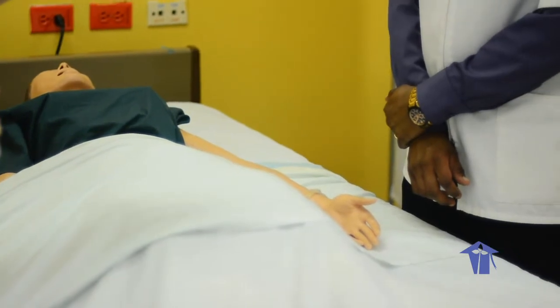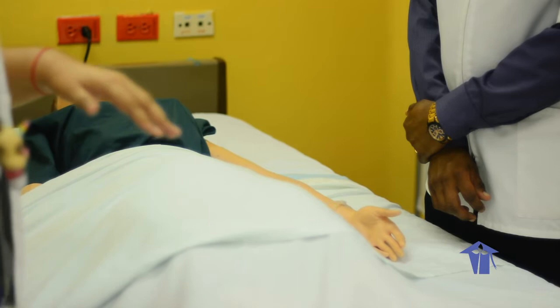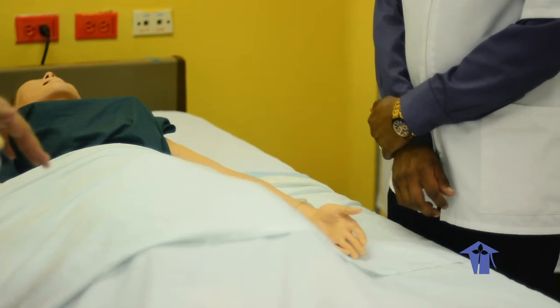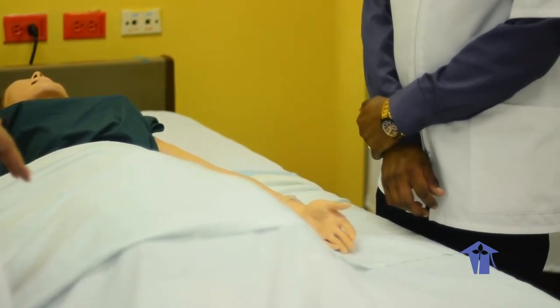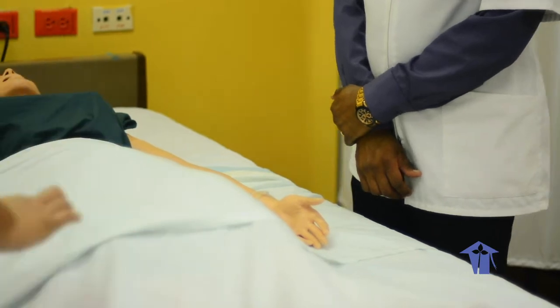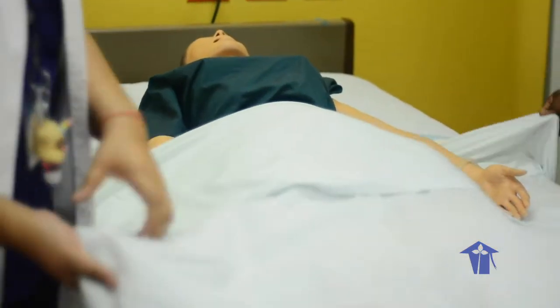So you raise the bed to the shortest person's waist height, right? So we are going to raise the bed. We've already got permission from our patient.